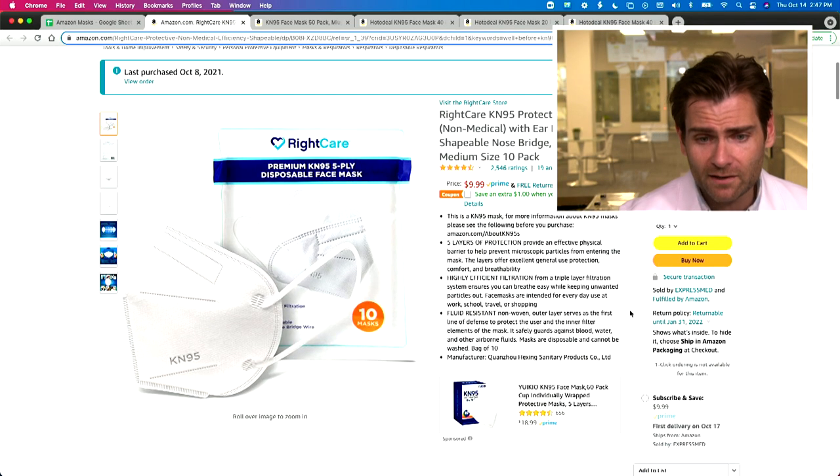Let's check out the mask real quick. I've seen better construction, but it's not the worst. Try it on — it's a little tight, as you can see, giving me little elf ears. I'm gonna have to visit Santa's castle.